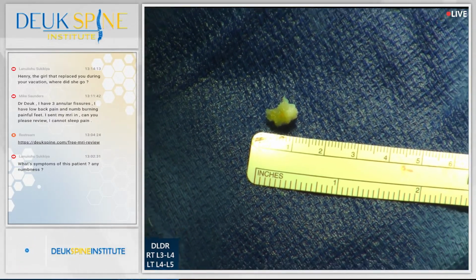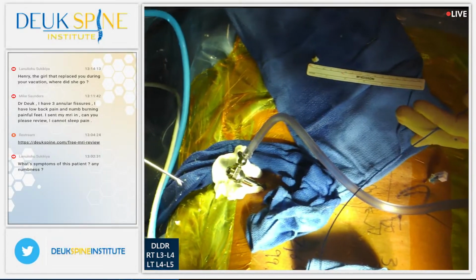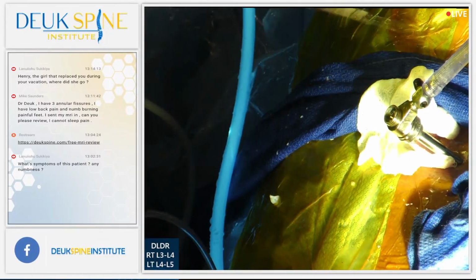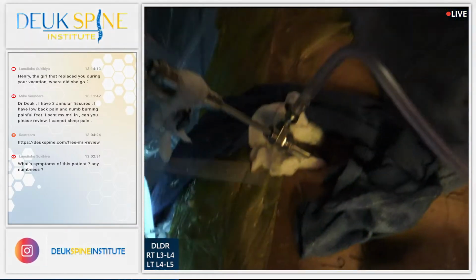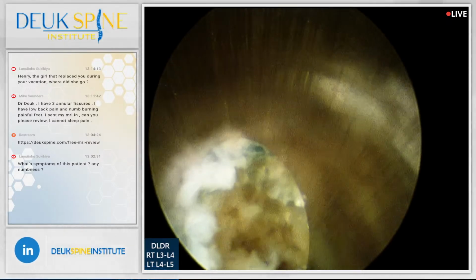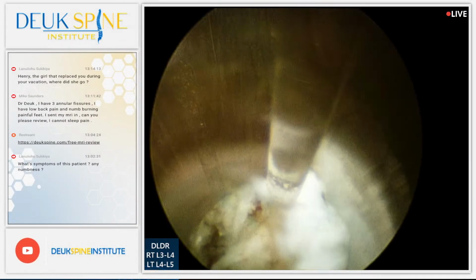Yes, we can. All these little pieces of herniation came out of this tube right here. As soon as I release them with the laser, they come up and out. They overflow out into the bag. We don't really keep track of them, but I would say the average patient will have about 30 pieces of herniation, we call them fragments, in each disc herniation. So if you say the patient has an L4-5 disc herniation, typically we'll find about 30 pieces of herniation in that L4-5 disc.